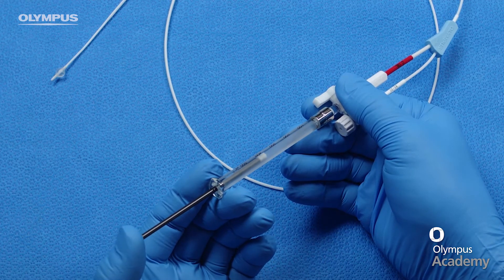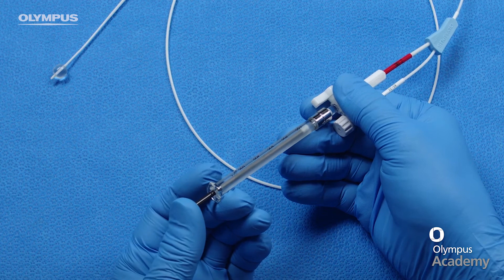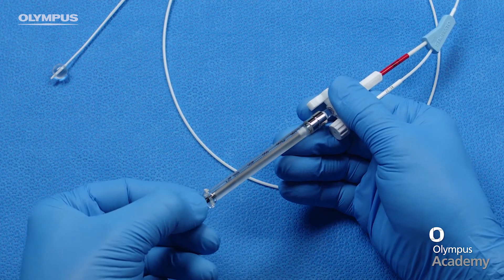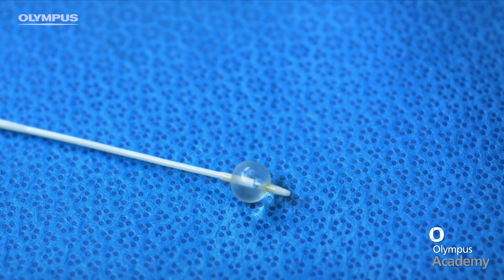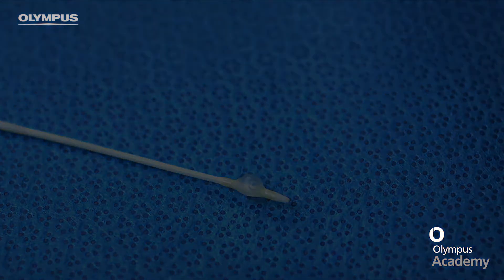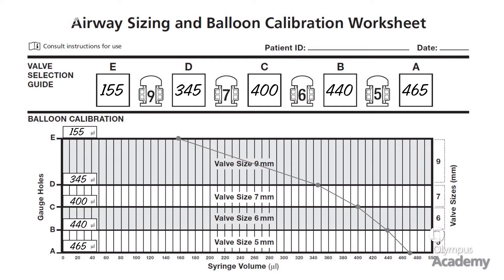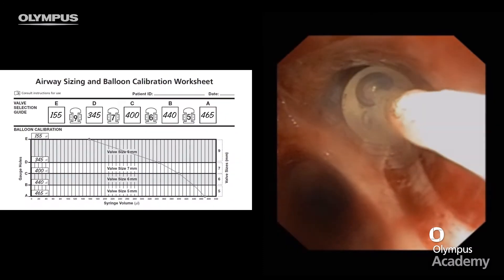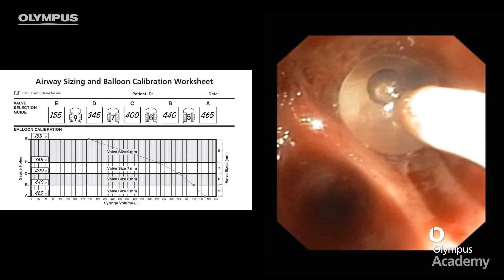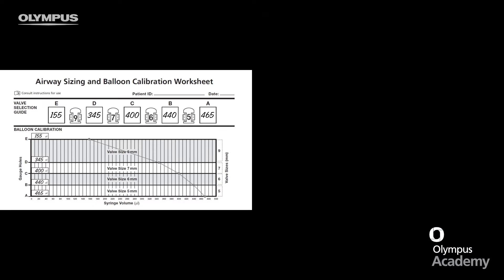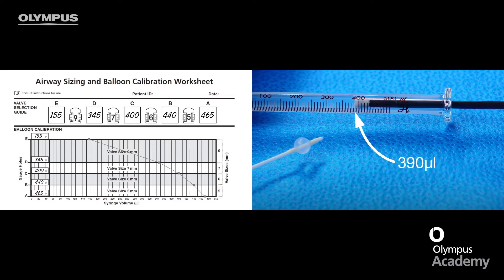Once the targeted lobe is determined, we need to size the airways prior to insertion of the valve. This is done with a specially calibrated balloon, which also serves as a sizing balloon. At the end of balloon calibration, a special worksheet is created and used during the valve case to determine airway size. When complete occlusion is achieved, the volume remaining in the syringe is compared against the calibration chart. In this instance, the volume left is 390 microlitres, which falls between 345 and 400 microlitres — the range for a size 7 valve.